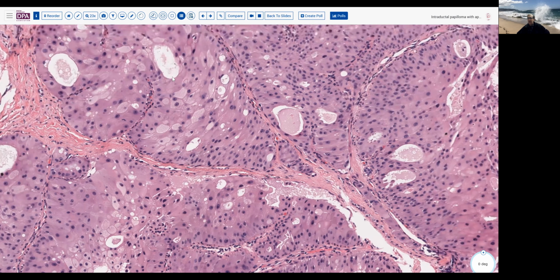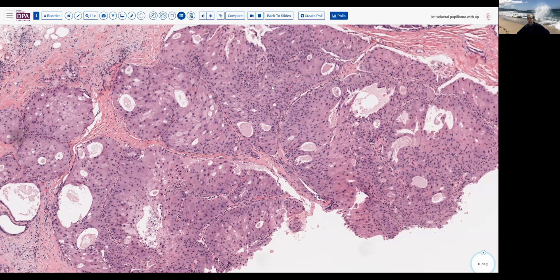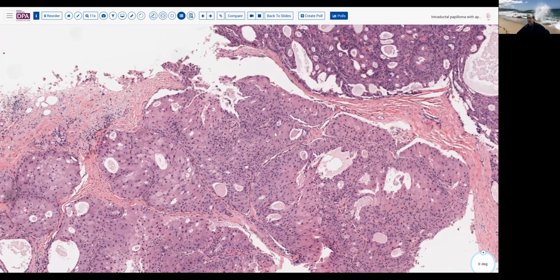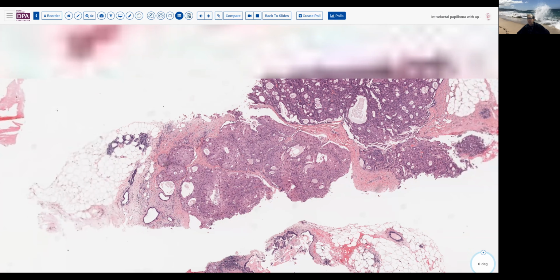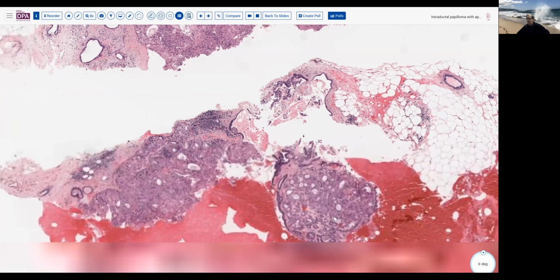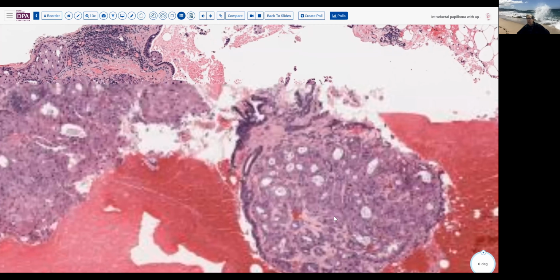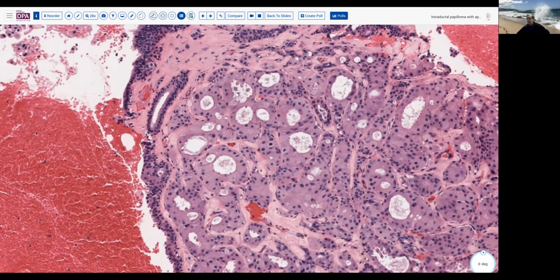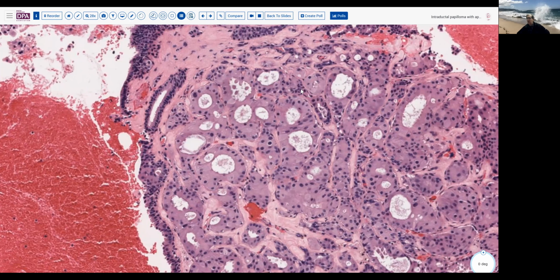So this is sort of maybe an in situ kind of area here, where we've begun to fill the lumen. And we'll see, I think, in other areas of this tumor, evidence of invasive tumor down here. So here we're seeing a more likely to be invasive pattern of this tumor with smaller nests, occasional single cells, and so forth, involved in this background fibrotic tissue.